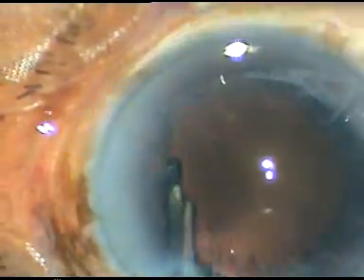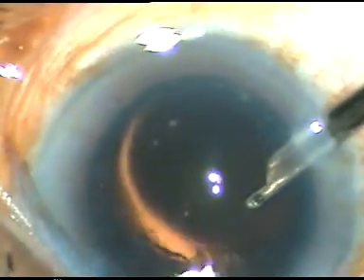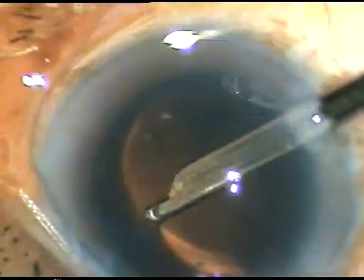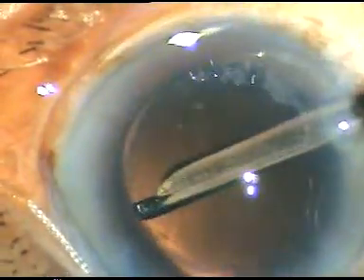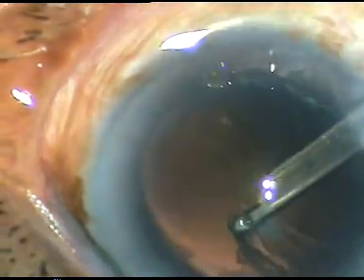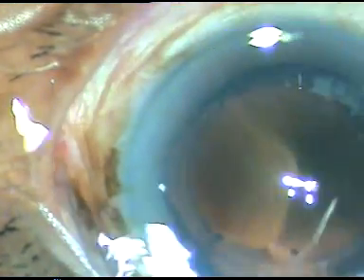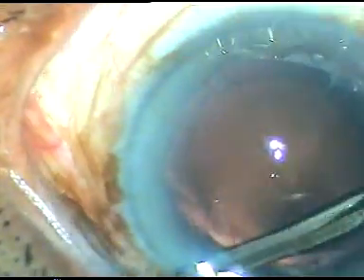In this case, some little bit cortical matter was there. There is no epinucleus, so the cortex is being cleaned out. At this time I am at the right side port, and the cortex from 11 o'clock to 3 o'clock is being cleaned out. So the cortical cleanup is done.